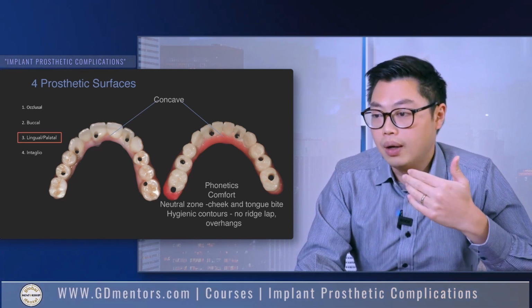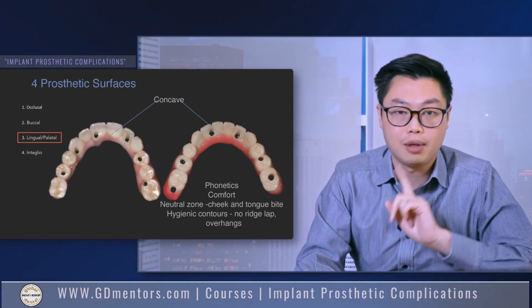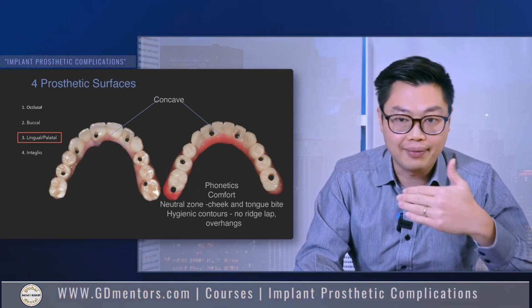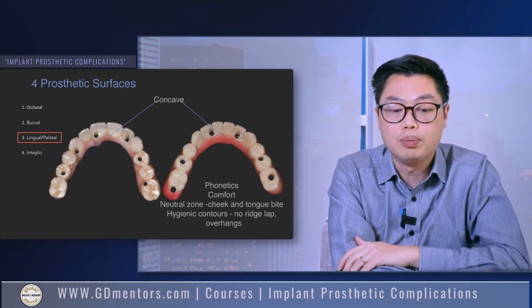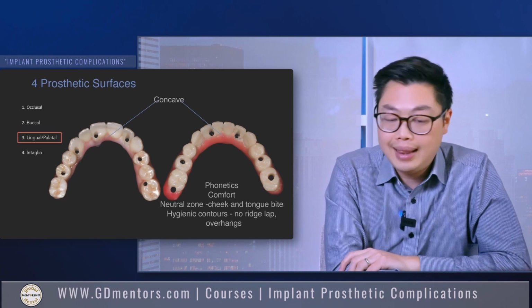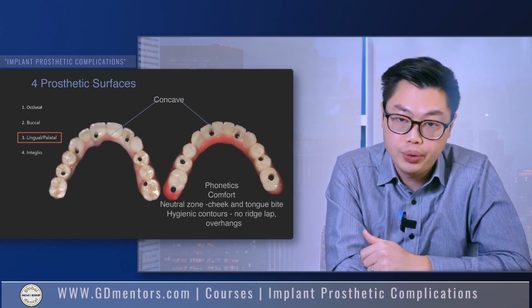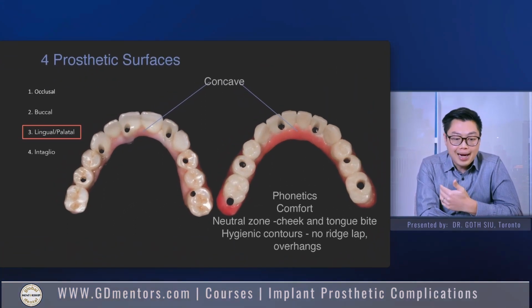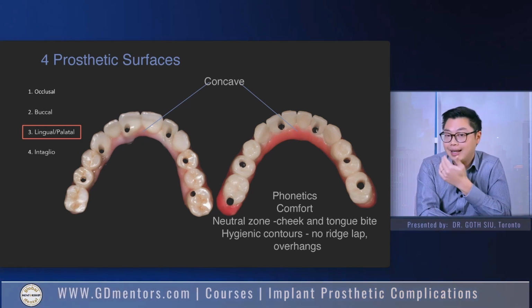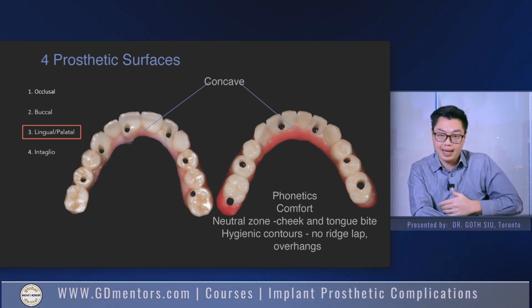There's not many good solutions, right? Sometimes, obviously, the implant needs to be deeper, right? If it's going to be lingual, they have to go deeper, because if it's always pretty much on the palate, and the implant isn't placed deep enough, and you got to connect everything, there's going to be huge bulk on the palatal area, and the patient cannot tolerate. Sometimes they speak fine, but they feel like everything is too bulky and it's a comfort issue. So one strategy for that is actually designing using a metal substructure and making the lingual aspect as thin as possible in pure metal, and then the ceramic starts in a more anterior aspect.